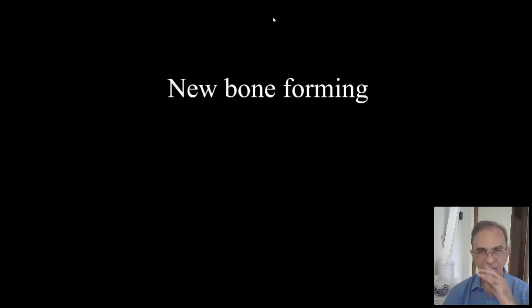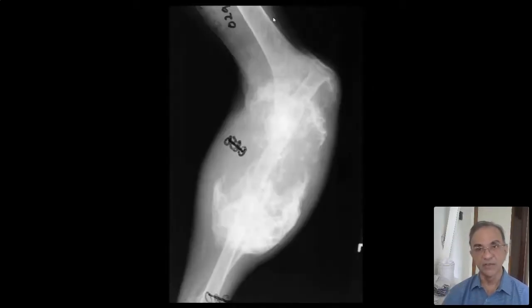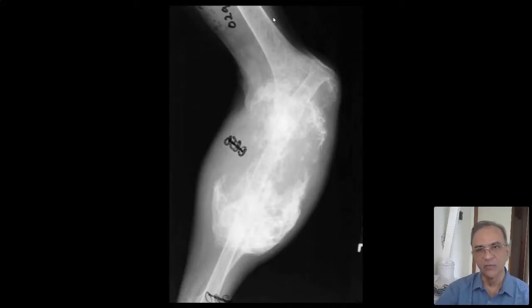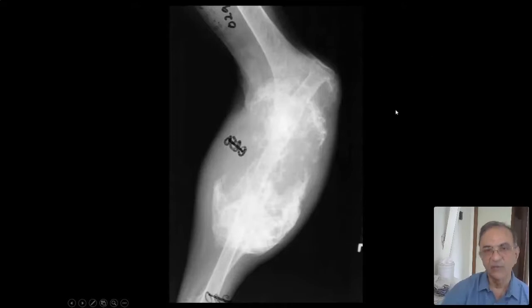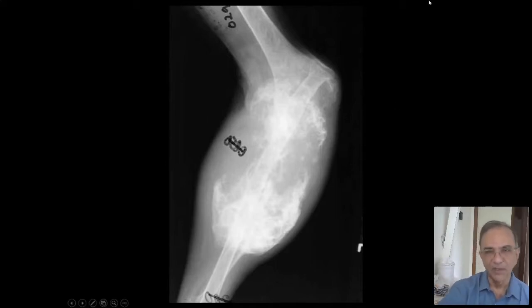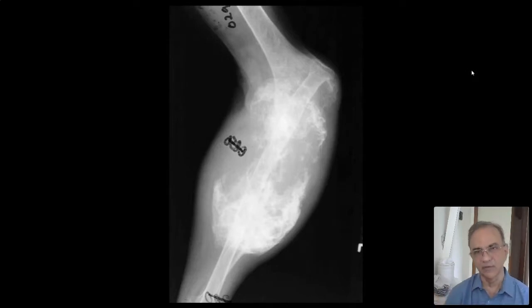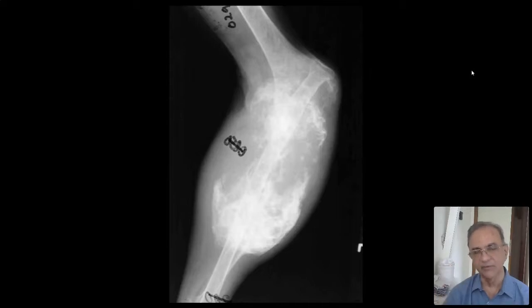Now, bone-forming tumors — new bone formation does not mean old bone is not destroyed. You look for white stuff on plain film. Here is a case with long-standing dislocation of the elbow showing a lot of abnormal anatomy but with new bone formation and chunks of calcification. For all practical purposes this is a chondrosarcoma. Here the zone of transition is difficult to define, but if you do multiple images and CT, it becomes easier. The appearance looks malignant — this is a bone-forming malignant tumor; osteogenic sarcoma doesn't grow like this; this is a chondrosarcoma.